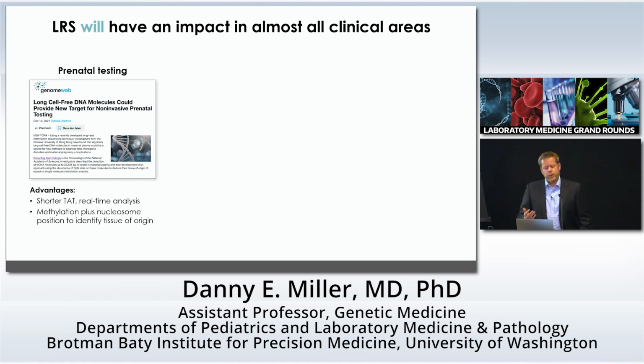With cell-free DNA, we can isolate cell-free DNA, of course, and sequence it on a nanopore machine or on a PacBio machine as well. Given how the technology works, especially nanopore, you can essentially get that data in real time, and you can imagine shorter turnaround times. You don't need to get 10 or 20 samples. You can do one sample at a time, as they come in. That gives you a quicker turnaround time, which can matter based on how laws are changing, honestly, in the United States, right? You want to know things sooner, and this kind of technology can give you that.